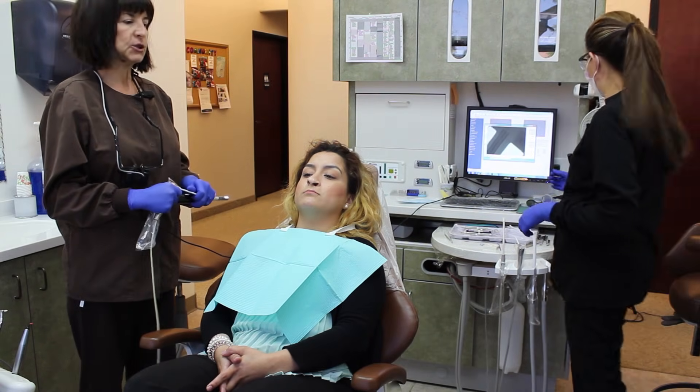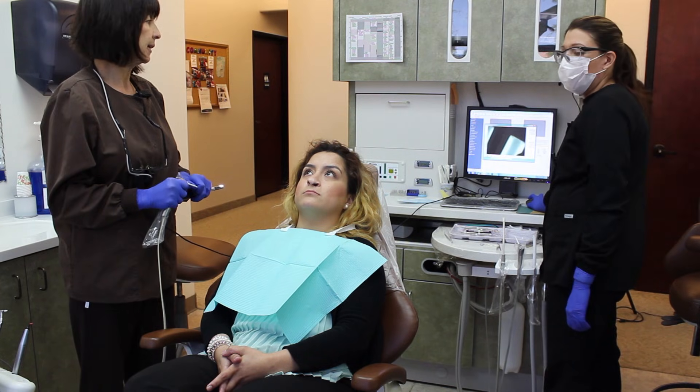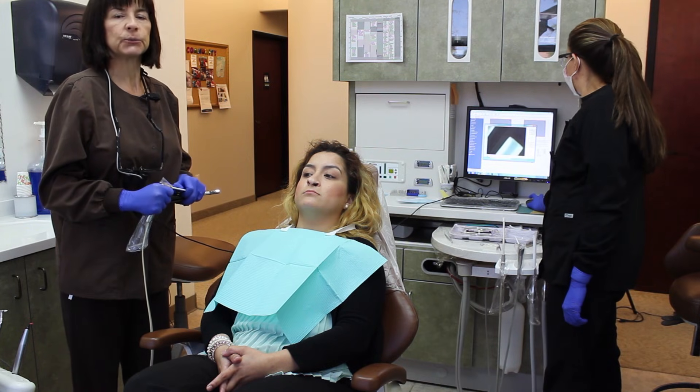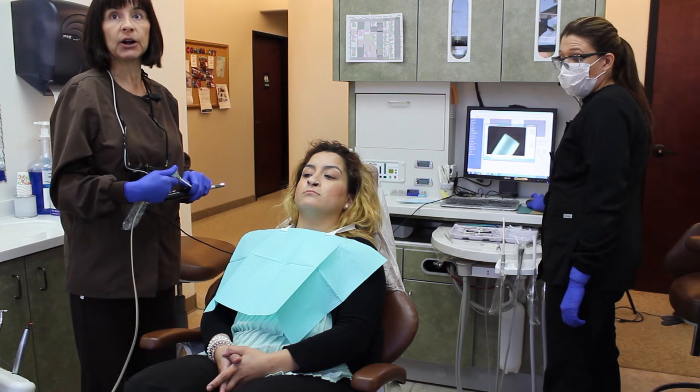Here I have my patient Julie. She came in today complaining of sensitivity on the upper right when she eats sweets and when she drinks cold liquids. So we're going to take a peek in her mouth and see what's going on.